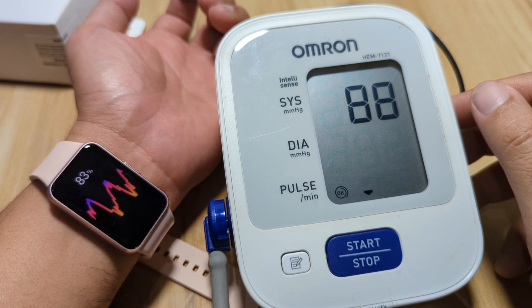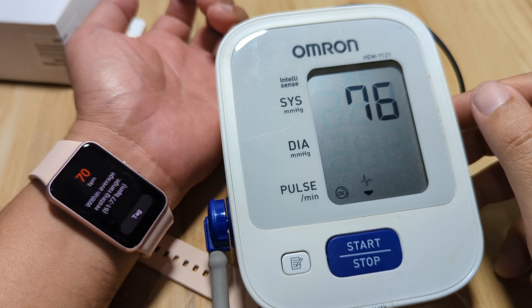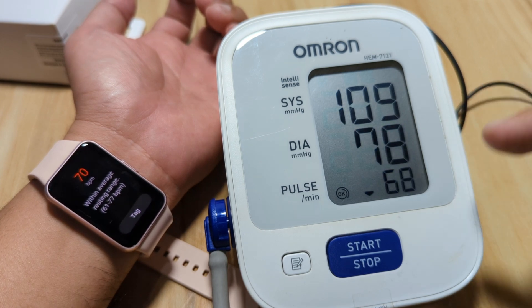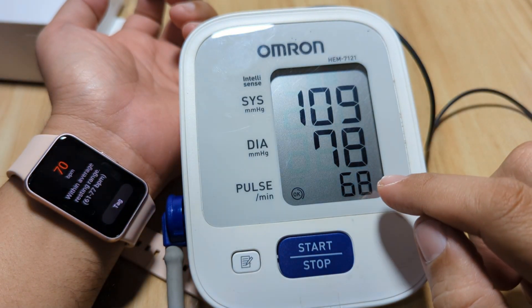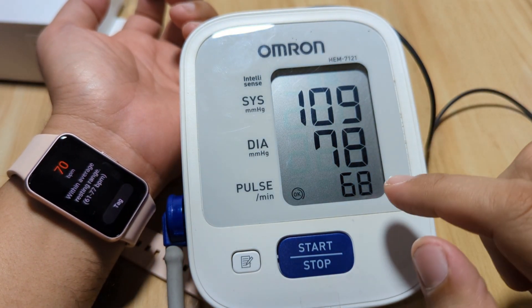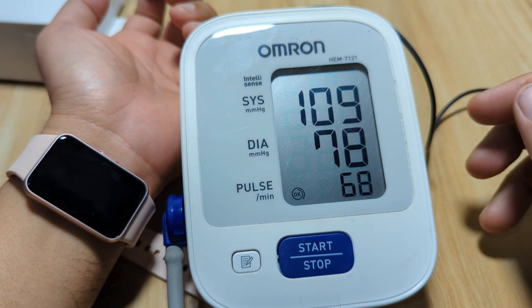Let's see the results. We are done with our Galaxy Fit 3 — we have 70 beats per minute. And we have here 68 beats per minute on the Omron. Very close — plus or minus 2. As you can see, we have plus 2 for our Galaxy Fit 3.